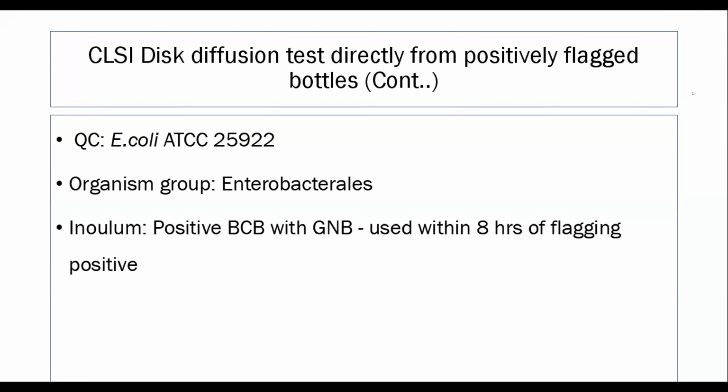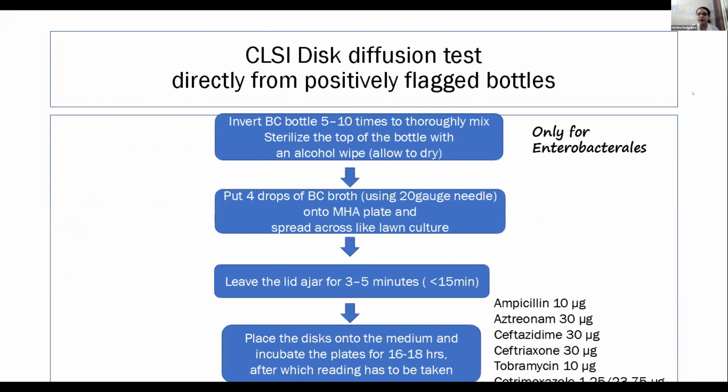So what to do regarding carbapenems if it can't be tested by DST? Carbapenems can be tested, right? Meropenem and all we normally test by the DST. In your list, I think it was not there, the previous slide. Can you please show the previous one?